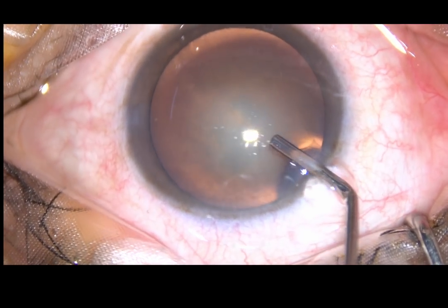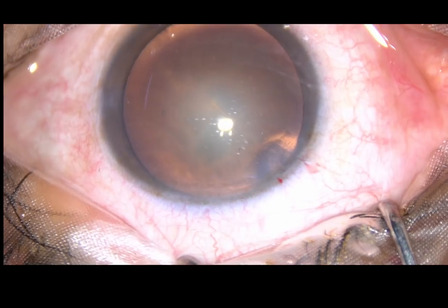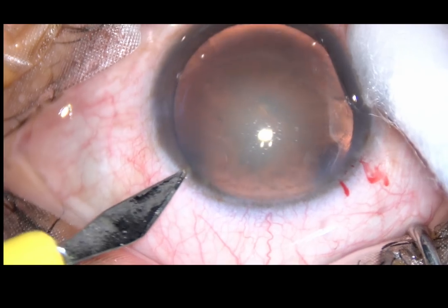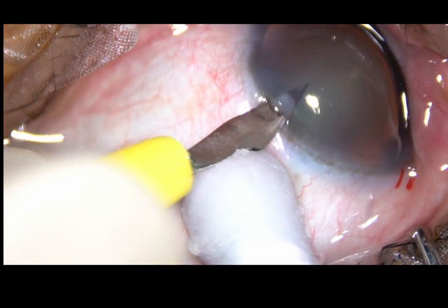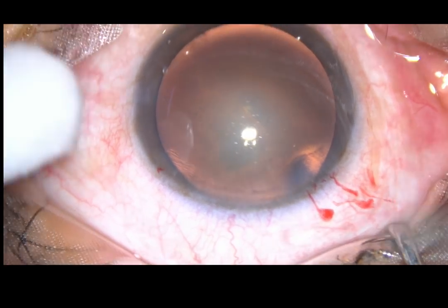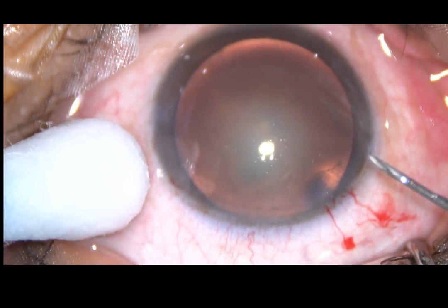This is viscoelastic substance, 2% HPMC. Now, one side port is being made on the left side of the main incision, about two and a half clock hours away. Now, capsulorhexis.